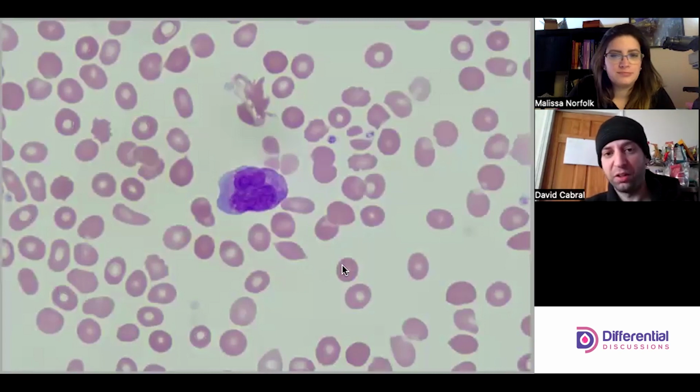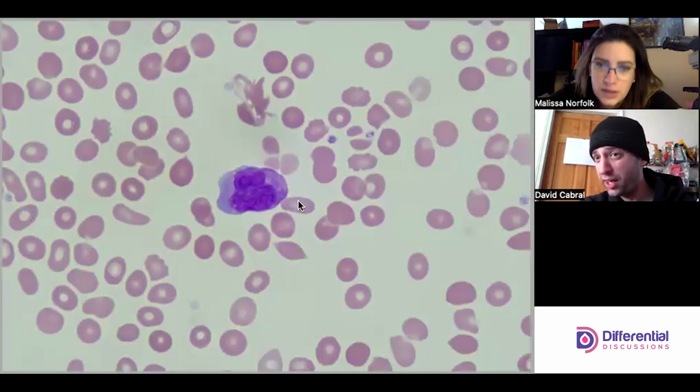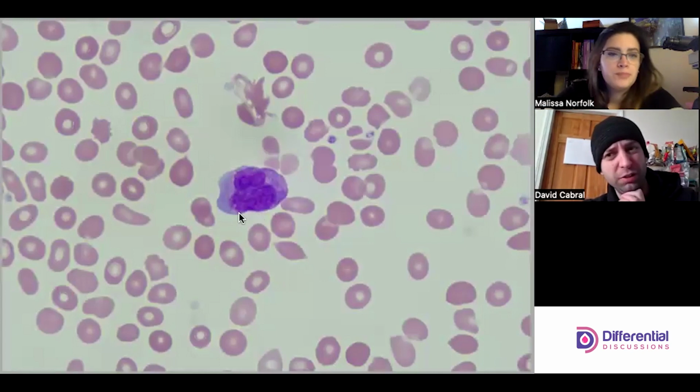Isn't it ideal where it's the nuclear morphology that informs the cell call? I think the nucleus is just the more important factor. So if we focus there, it looks like we see two hemispheres or two lobes, right? Monocytes will fold, but they don't necessarily make lobes, do they, Melissa? Not usually, it depends. But again, this cell looks malignant. It's just the origin that we're wondering if it's monocytic or promyelocytic.